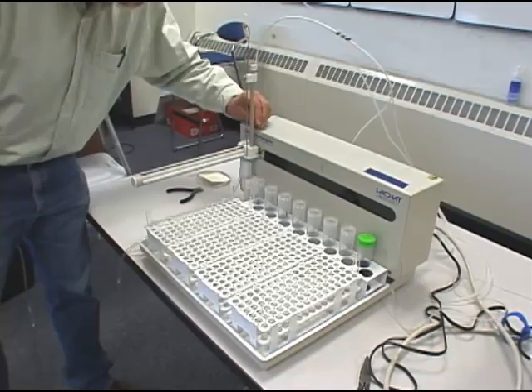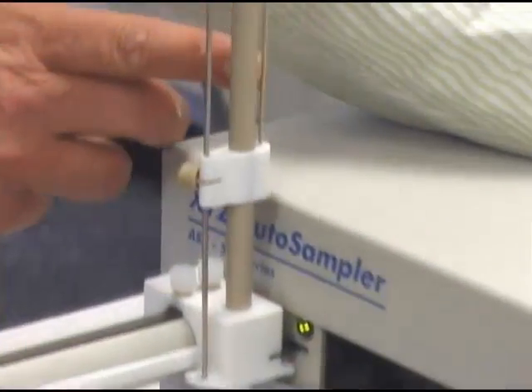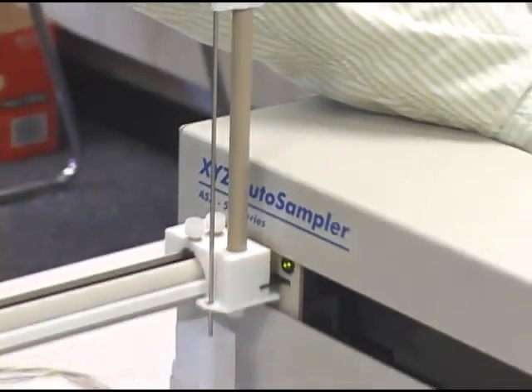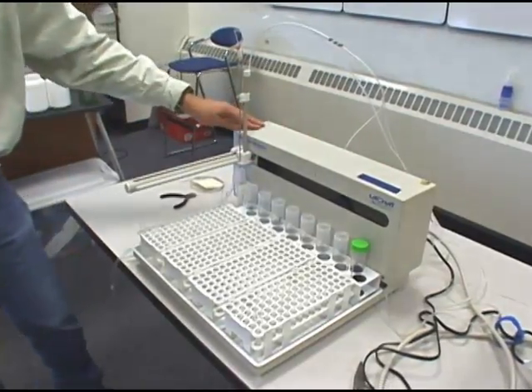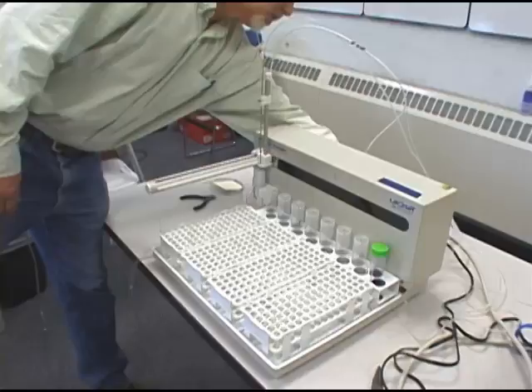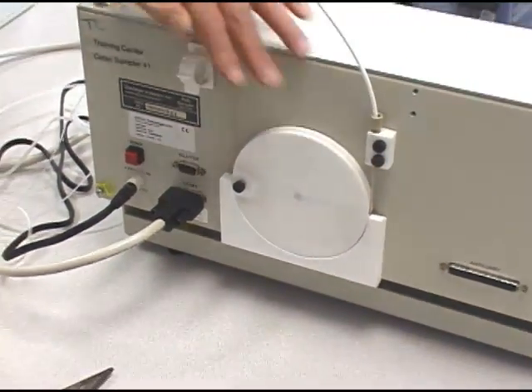Sometimes this peak tubing can get damaged and needs replacement. So the first thing we're going to do is turn off the instrument, and then we'll loosen the thumb screw on the back linkage wheel so that we can remove the peak tubing.